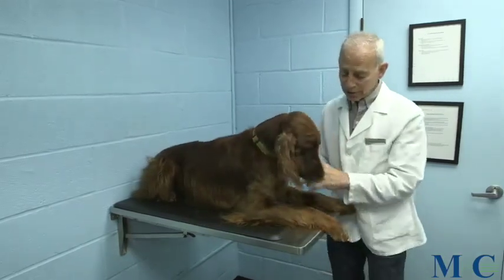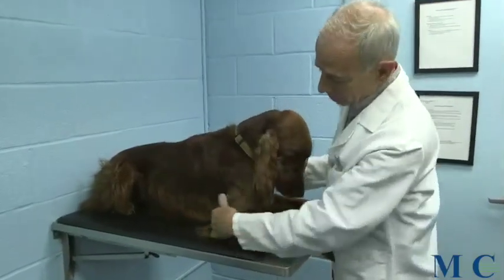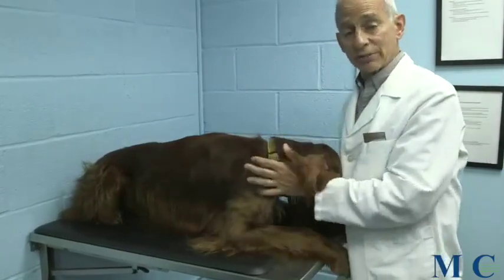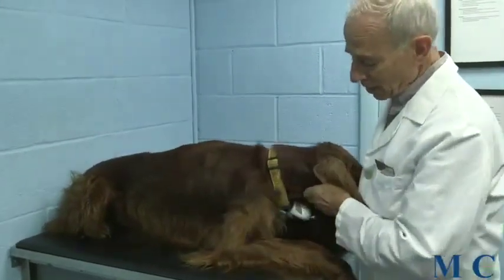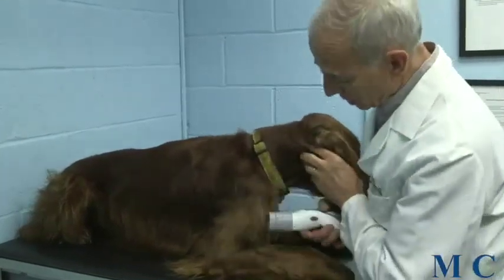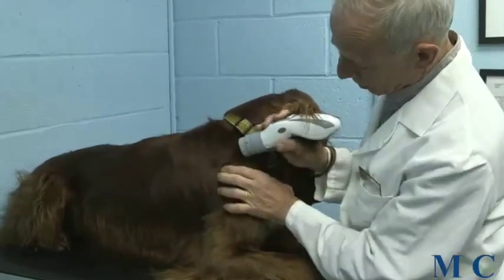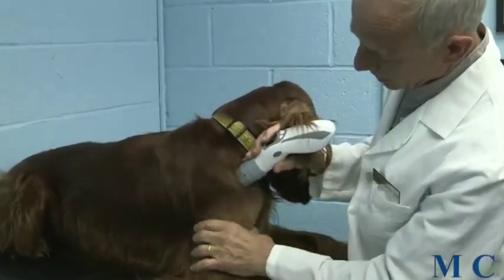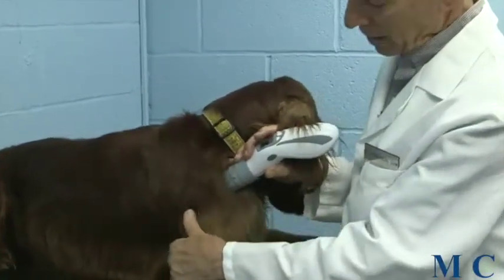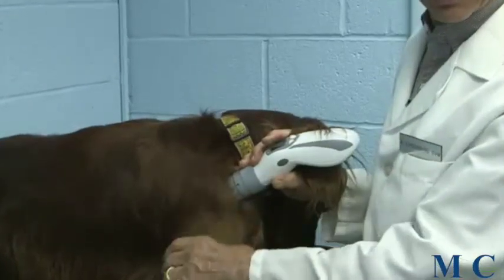Let's say that we're treating something such as a front leg — say that Lou had osteoarthritis of his elbow. Here's his elbow here. We would first treat the regional lymph nodes in order to enhance circulation. The regional lymph nodes for that would be his prescapular lymph nodes, so we would be placing the laser unit right over his prescapular lymph node, right in this area. We would then apply it for the prescribed length of time depending upon the parameters of the light device we were using.